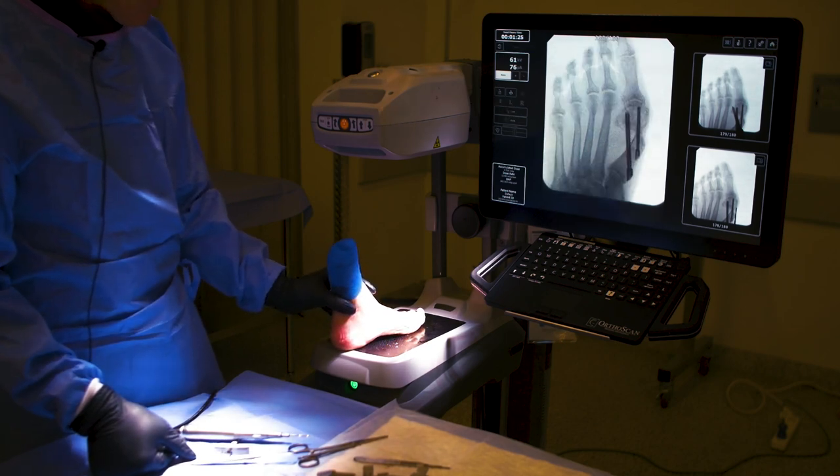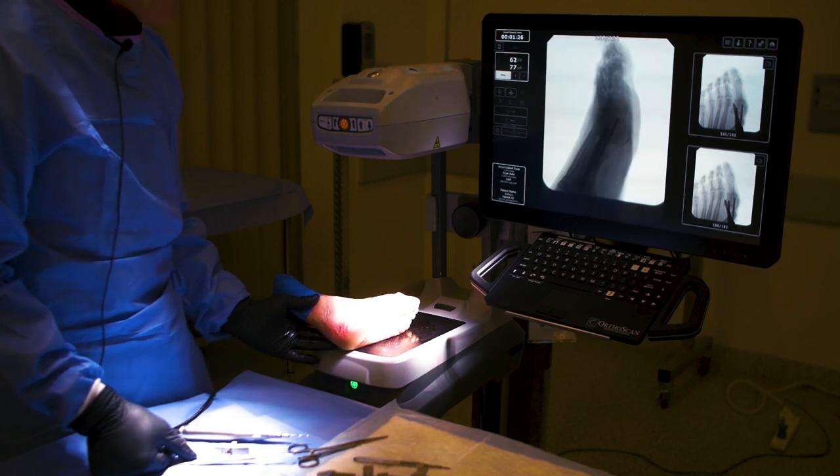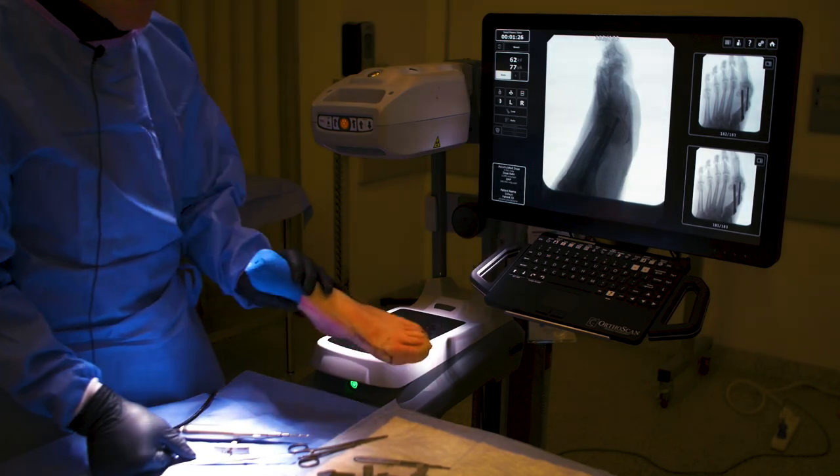Let's see final imaging. I'm happy with that, and I'm very happy with that — nice spread. I definitely don't want to go any deeper with my screw, but there you go.